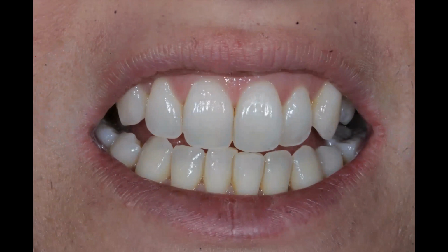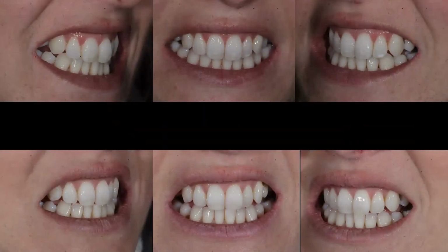And that's a few minutes later, just once things have rehydrated and we finished our polishing, and you can see the white spots. We actually kind of dealt with those quite well. Her teeth now are the same color, which is what she came in asking about. So we see the before and after there.